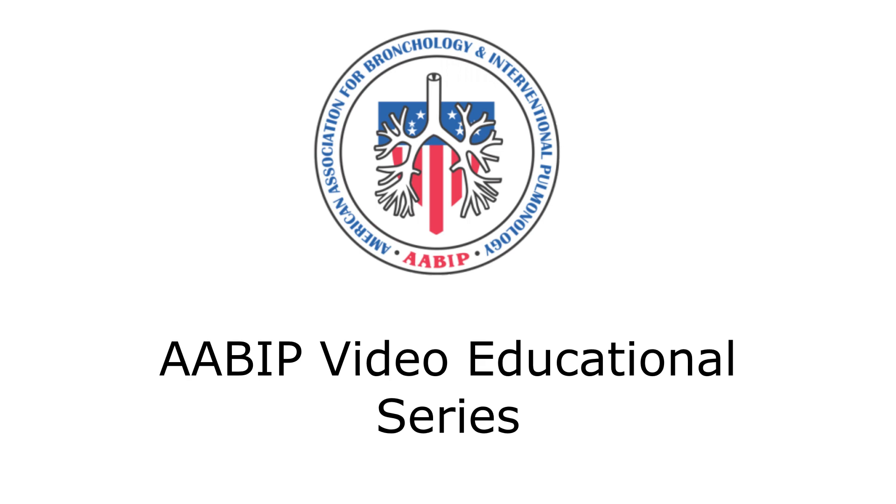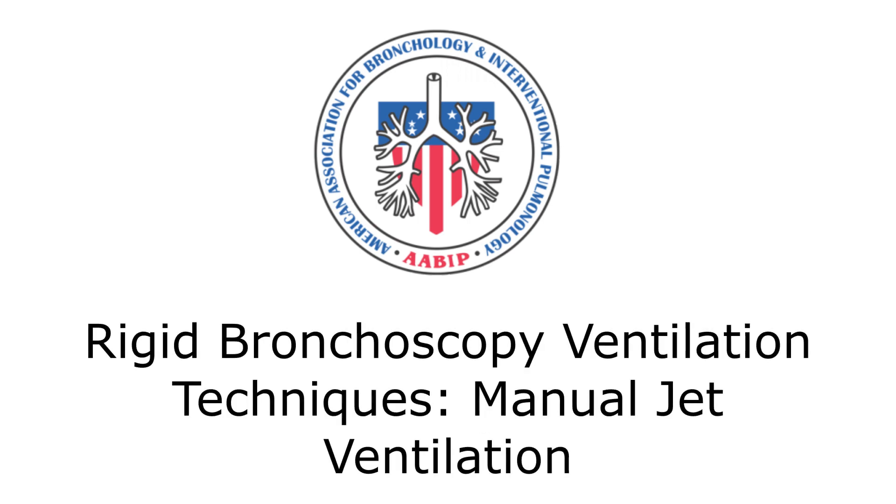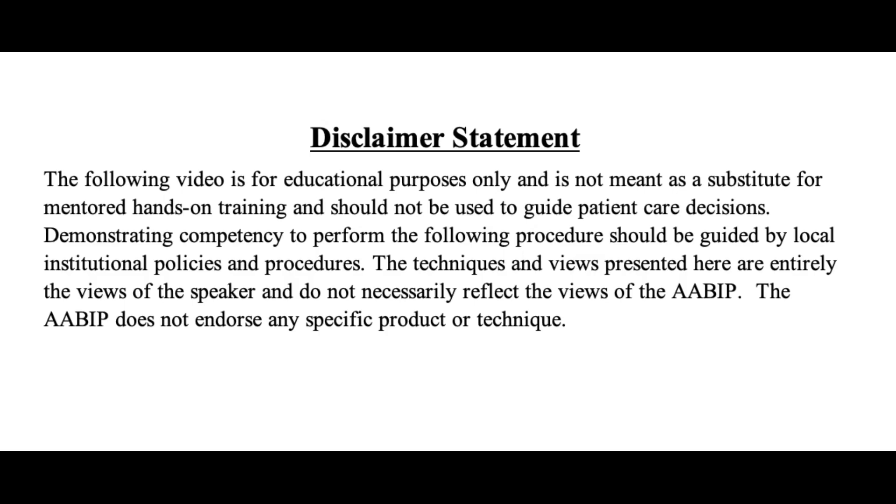AABIP Video Educational Series: Rigid Bronchoscopy Ventilation Techniques — Manual Jet Ventilation. Connecting Manual Jet Regulator Hose to Rigid Scope.